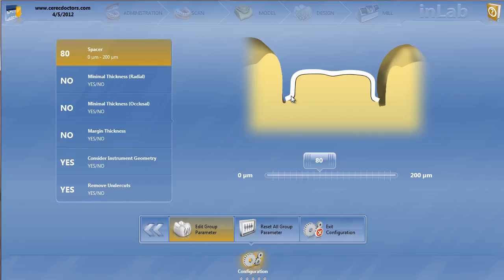When I typically do this as a dentist, I make copings to try to hide dark substructures. So if I have a really dark tooth, just a black stump from a root canal tooth, a lot of times I'll make a coping in like an Emax MO, like a medium opacity, or maybe even a zirconia if it's really dark, but generally Emax MO.